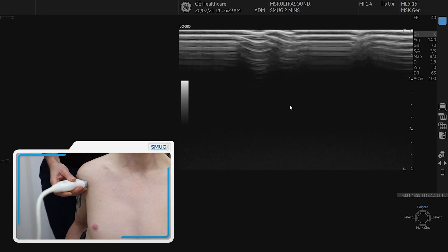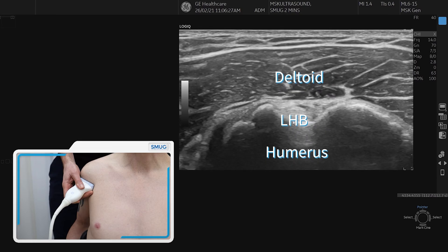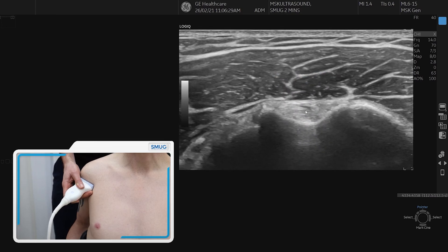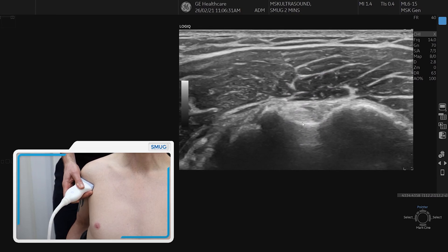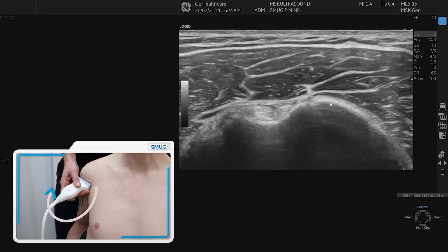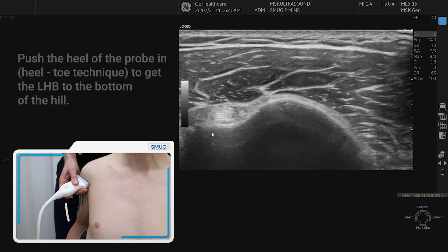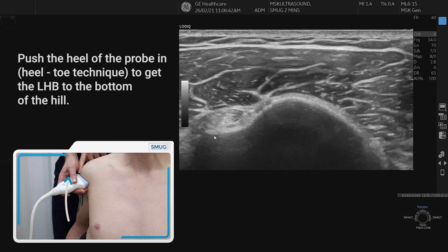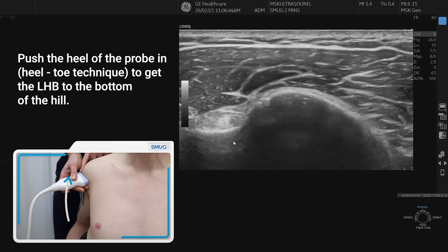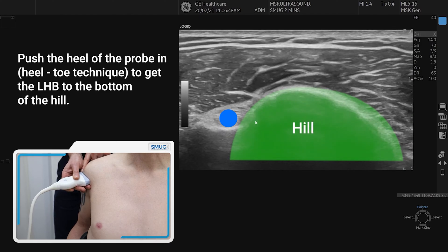What we then do is we find the long head of biceps sitting within the bicipital groove. The next thing we do to get a transverse image of supraspinatus is to come laterally round the arm to bring the long head of biceps to the side of the screen. We're then going to heel the probe in to get the long head of biceps to the bottom of the hill, which is the greater tuberosity.